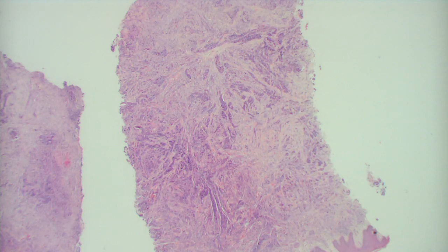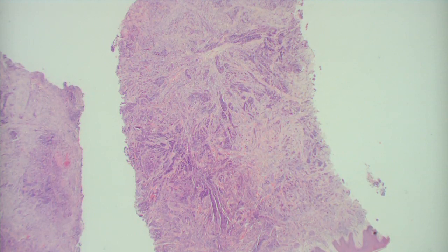So in this one, it looks like actions deeper in the dermis. It seems that there's kind of this diffuse dermal infiltrate. Seems like up top, relatively spared. Nothing much going on there. Exactly. Deeper process.